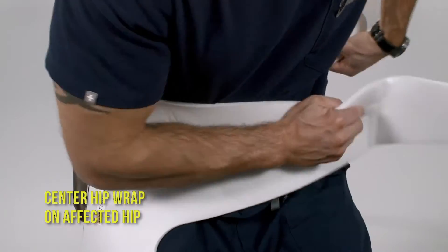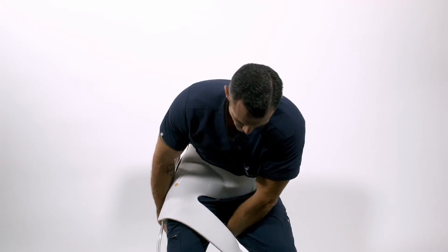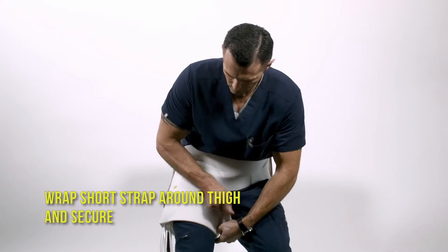Center the hip wrap on the affected hip and wrap the long upper strap around your torso. Wrap the short straps around the thigh and secure.